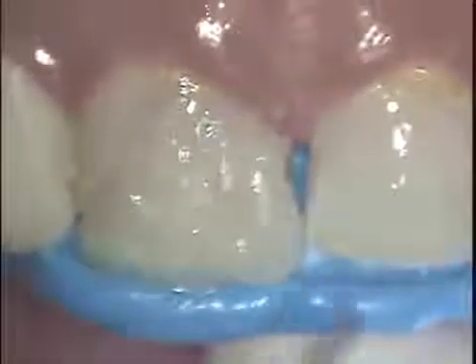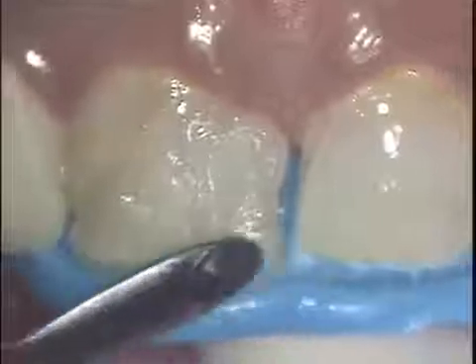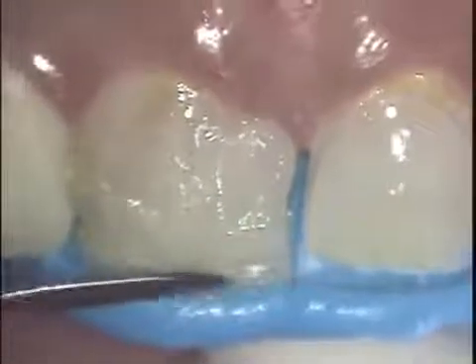Again, it's important to see why the use of this matrix is so critical and helpful in many of these cases, because it allows us to sculpt the composite exactly where we need to using a visual aid as well as a form to place the composite against.